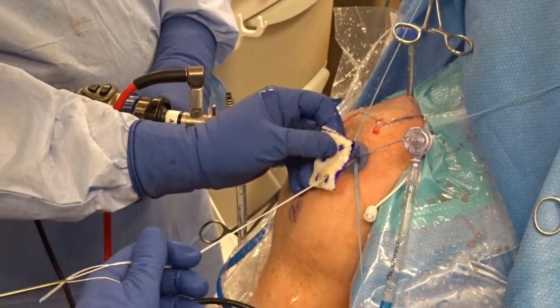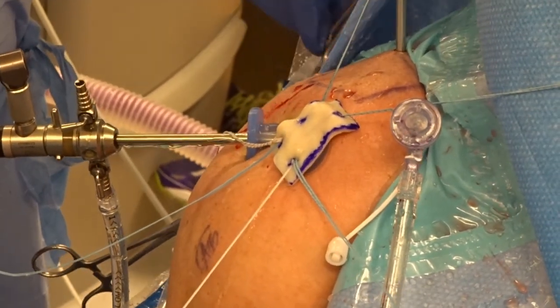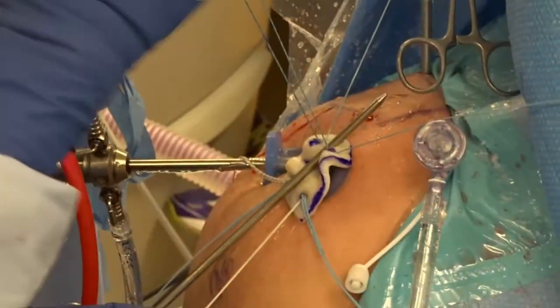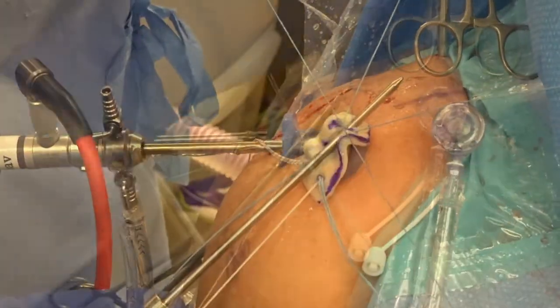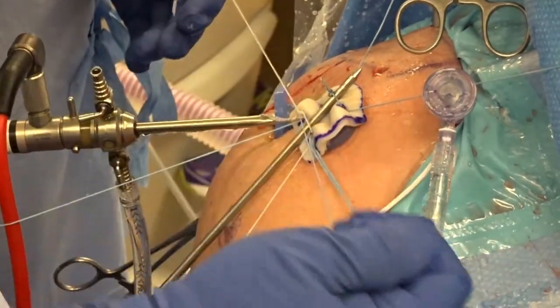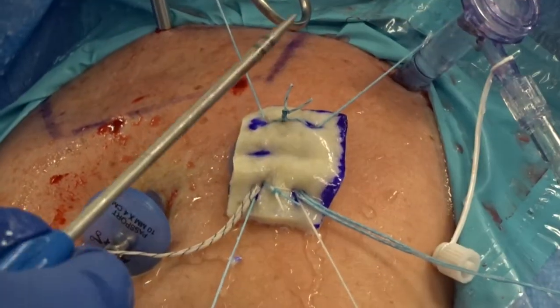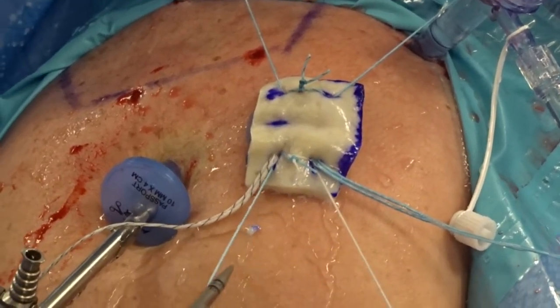After the sutures are passed through the cannula, each suture set is passed through the respective punched hole in the graft. Medially, one fiber wire limb from each suture tack is tied together. Laterally, one fiber wire limb from each swivel lock is tied together. This creates two double pulley systems — one medial and one lateral.